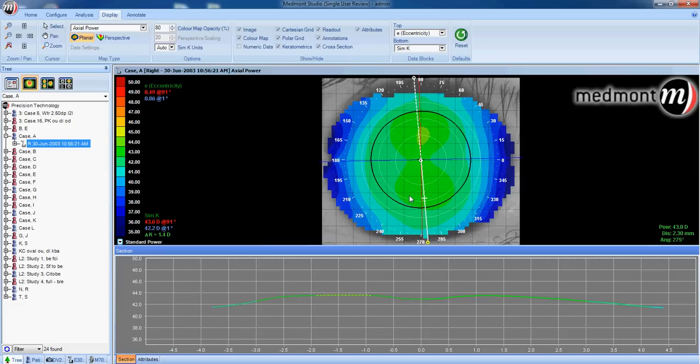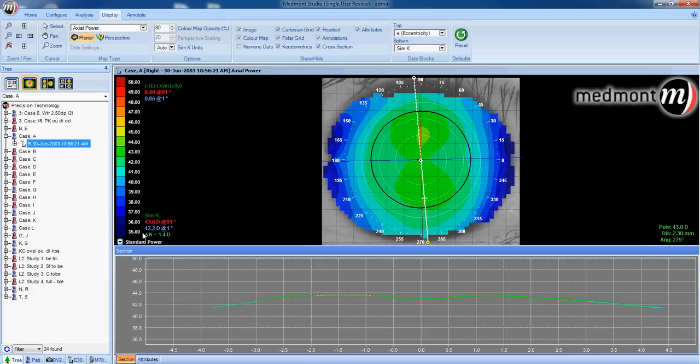The redder the colors of the map, the steeper the corneal topography. The bluer or colder the colors are, the flatter the topography. In this case, we have green contours near the center. This is a pretty median cornea.